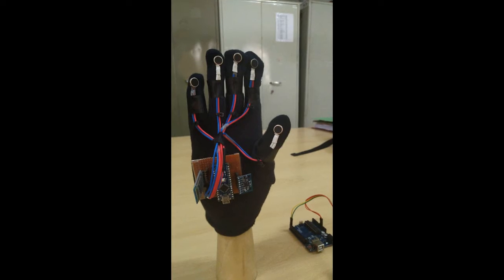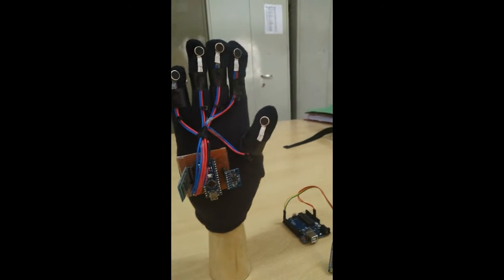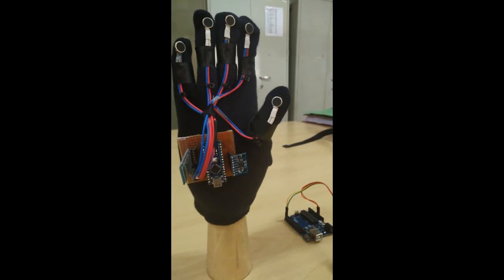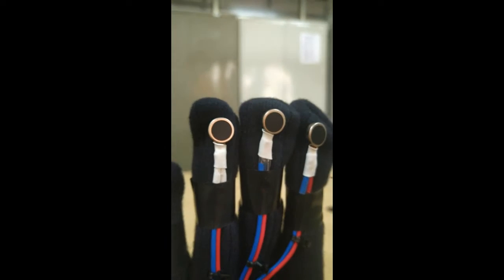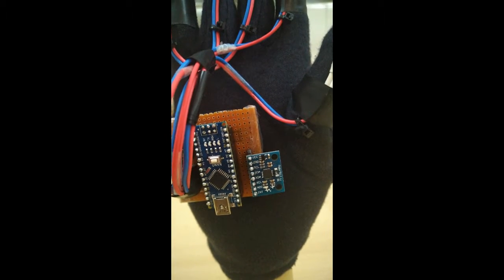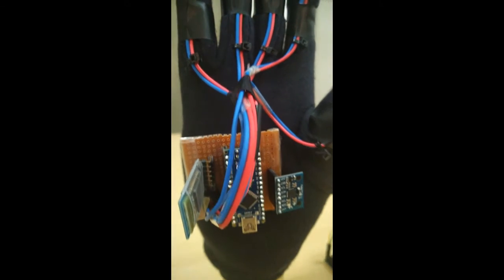Thank you. We are going to explain the proof of concept and the hardware setup that we have built from scratch towards working on the Parkinson's glove. Here you can see the hardware setup that we have used, and each of the fingers is attached to a coin motor. This coin motor is in turn controlled by a microcontroller here, and we have a gyroscope here as well as a Bluetooth module here. I'll explain the functionalities of each very neatly.